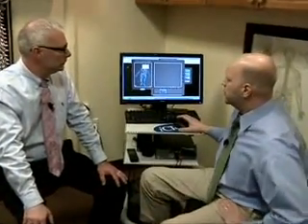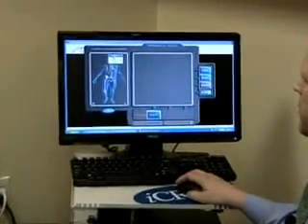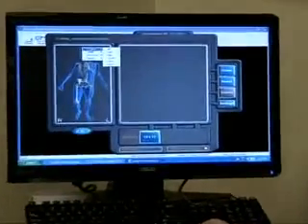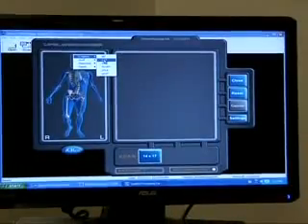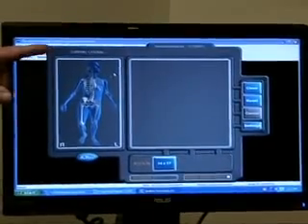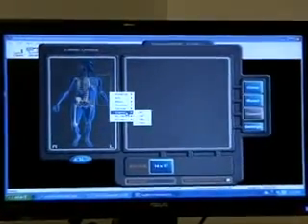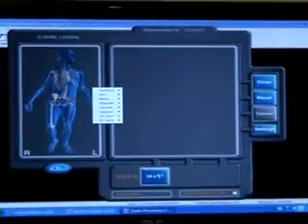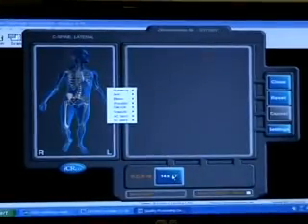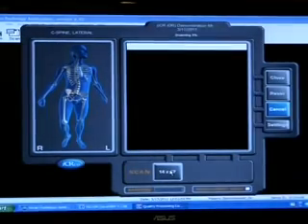Dr. K? So basically, after we decide what image we're going to take, we go to the scan screen and we pick the series that we're going to do. So we picked our cervical spine and we did a lateral. What this does is this allows it to put in the factors that are pre-programmed into this computer, the factors that we've taken with the screen, and that gives us a buffer area to allow us to process the film. So now when we hit the scan, our image will pop up of the one we just took.